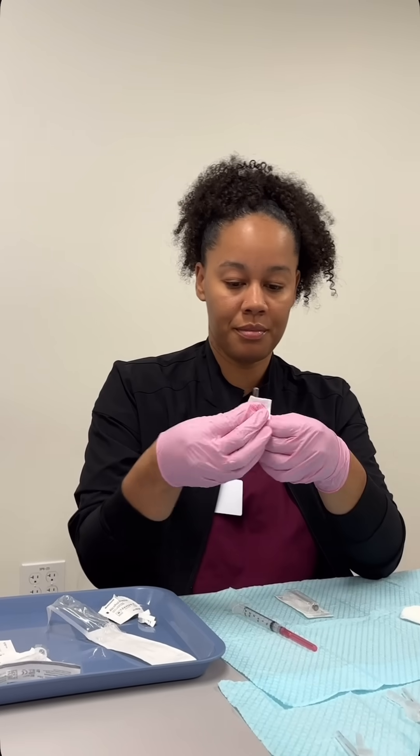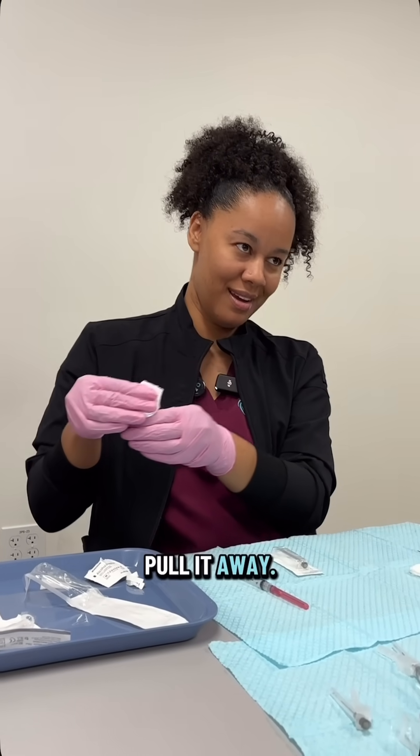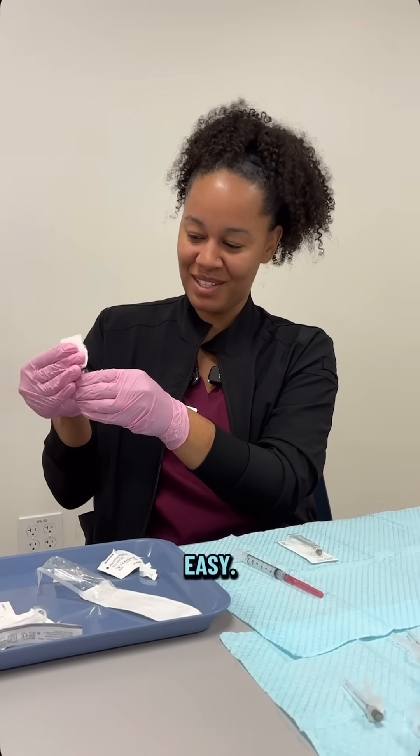First, I'm going to clean it. Now I'm going to break it. Pulled away. Oh, that was easy.